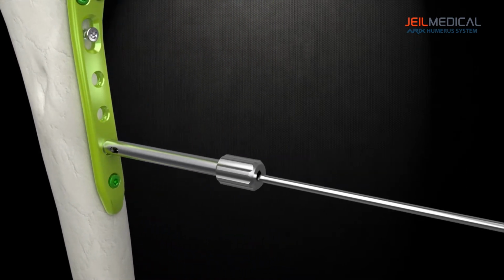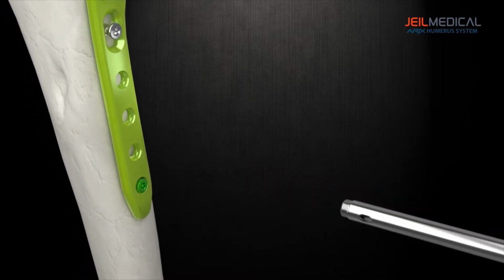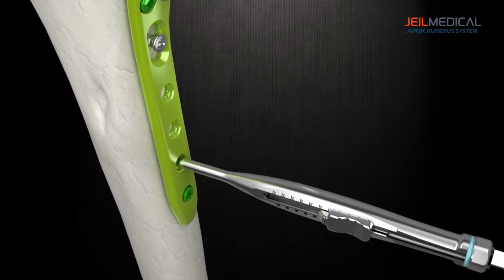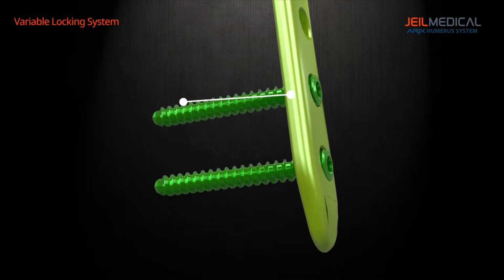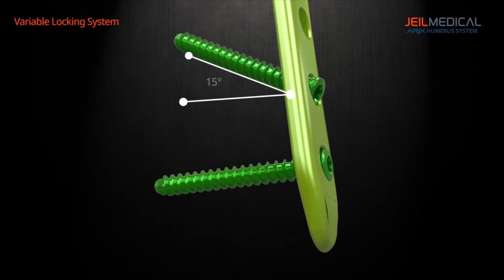The screw holes in the shaft are predefined for perpendicular fixation of the screw to the plate. However, screws can be inserted at variable angles of 15 degrees from the screw axis.